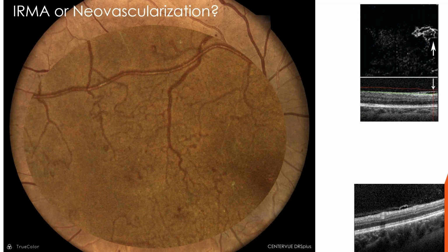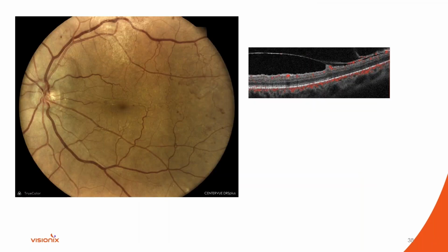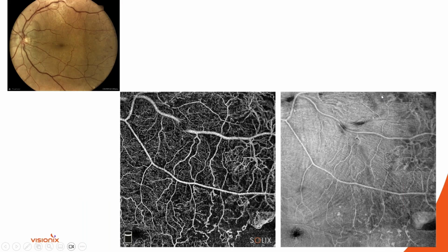And here's a highlighted image. You can really appreciate here what I was looking at, and I didn't know. Is this patient proliferative? Are they severe non-proliferative? Certainly I think we would all refer this if we weren't sure. Another example, here's a patient that has this area. Remember that when you have this red pixelation, it's an indication that there's active blood vessel growth in there. And look at this. Look at all of the neovascularization here.